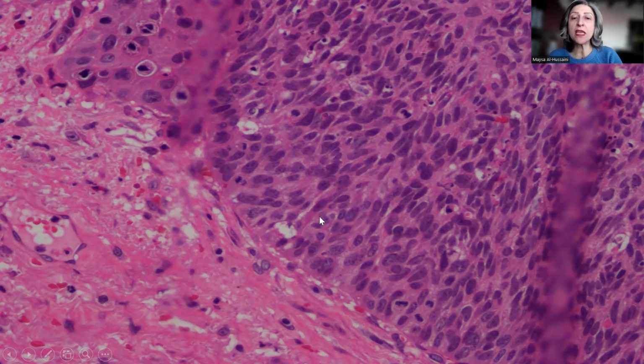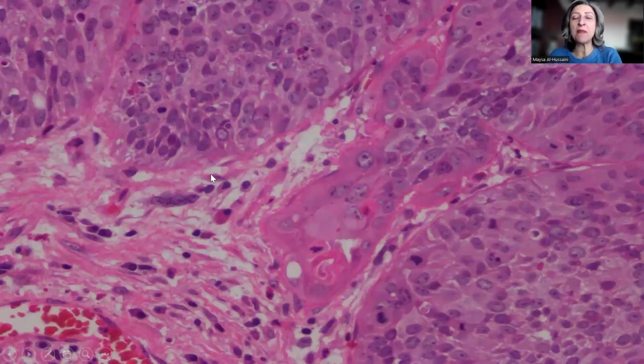of the squamous epithelium with the proliferation of those cells, the squamous cells that are dysplastic, showing similar appearance from the basal layer up till the very upper part of the squamous epithelium with basaloid nuclei, abundance of mitotic activity that would be consistent with carcinoma in situ. But I really want you to pay attention to the area here where we start to see some changes in the cytoplasm of the adjacent squamous epithelium. And more even clear here, this is the focus of carcinoma in situ or severe dysplasia or full thickness dysplasia.